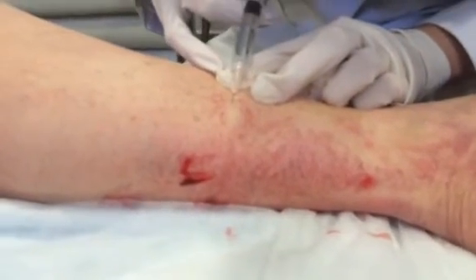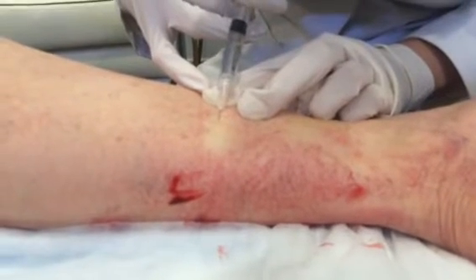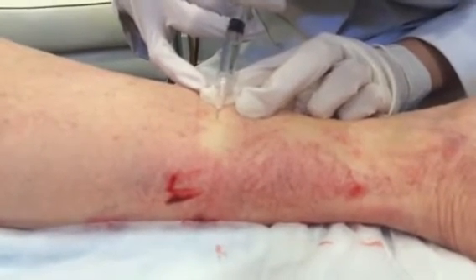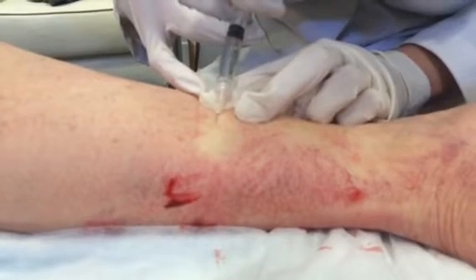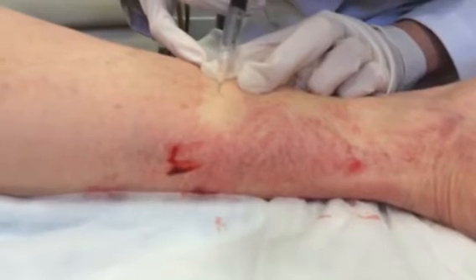And you can see that start to clear. You can see how all of these are interconnected, because just by getting into one of those teeny, teeny, teeny vessels, we're treating that whole field area.